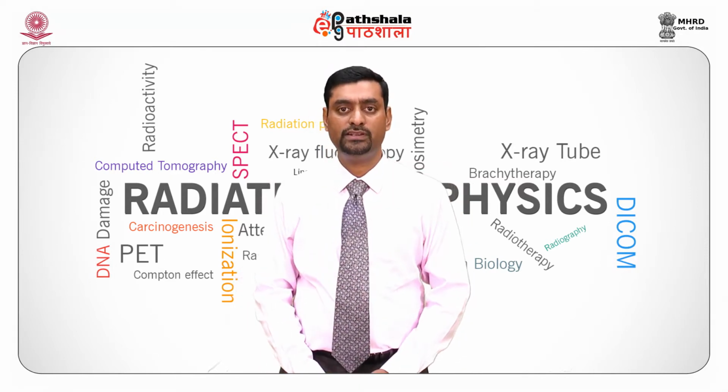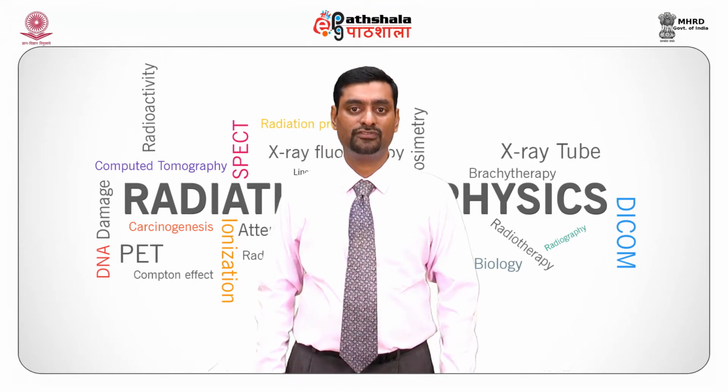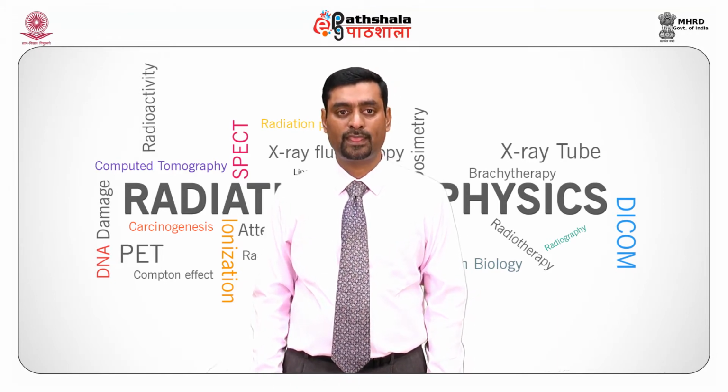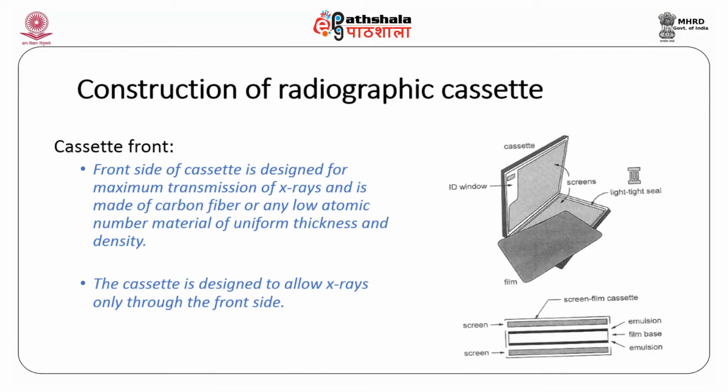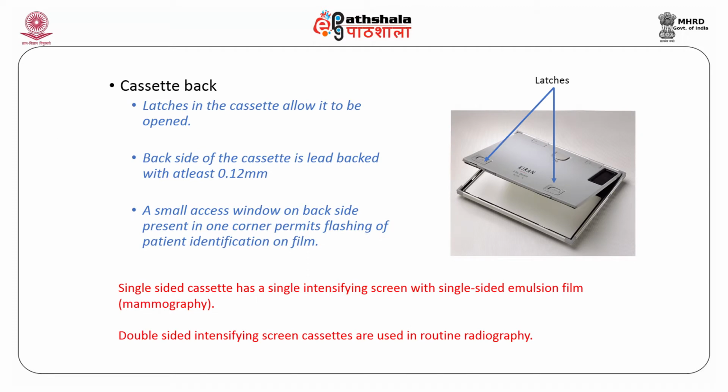Let's go into detail about the construction of this radiographic cassette. The front of the cassette is designed for maximum transmission of X-rays and is made of carbon fiber or any other low atomic number material of uniform thickness and density. The cassette is designed to allow X-rays only from the front side, as you saw in the illustration.